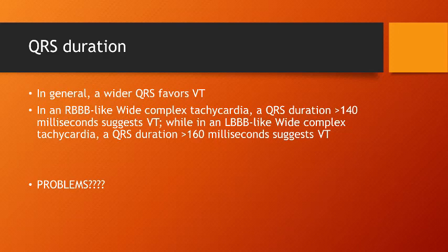There are several studies which have measured the QRS duration in VTs, and they have found that if the QRS duration is more than 160 milliseconds, it is a strong predictor of a ventricular tachycardia. However, a QRS duration of more than 160 milliseconds is not helpful in some settings, including SVT with an accessory pathway, in presence of drugs which are capable of slowing interventricular conduction, such as class 1 antiarrhythmic drugs, and hyperkalemia can also induce these changes.